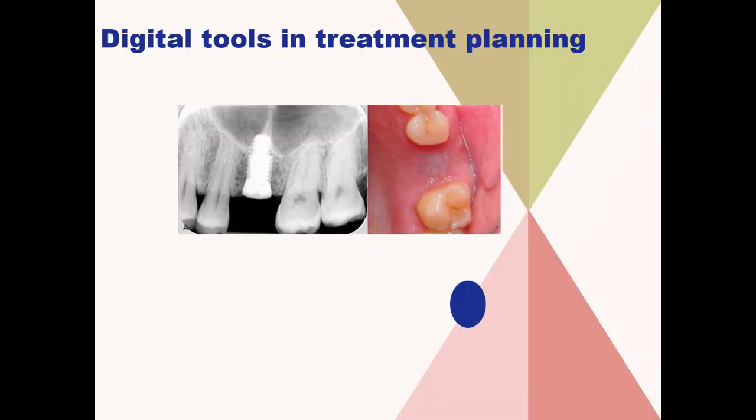Finally, coming to the digital tools in treatment planning. So now we know that the use of CT scanning and laboratory-based laser scanning technology, along with intraoral digital impression capture technology and with advanced software, help us to have an accurate representation of a virtual patient. And this concept has the ability to preview and even test different treatment options to enhance patient care, and it can also combine the data to develop a proper treatment plan for patient analysis and treatment. As a result, one can create solutions that would include all of the functional and aesthetic aspects of oral rehabilitation.